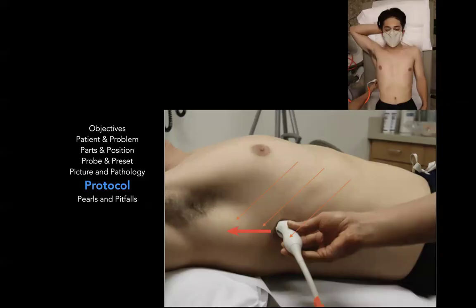What you want to see is that you're right at the junction between the liver, the kidney, and the lung. This picture here is really just to show that when you place the probe towards the patient's head, you're going to have ribs that are obliquely fashioned in this way.